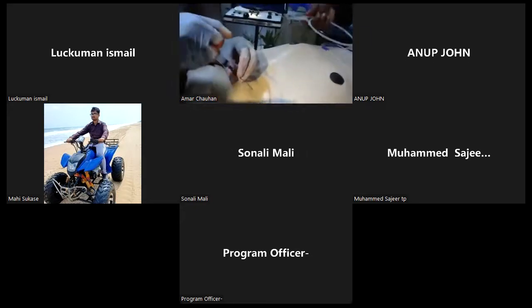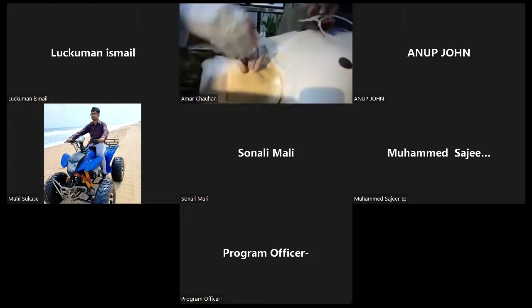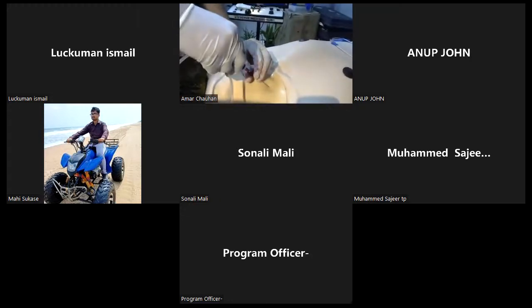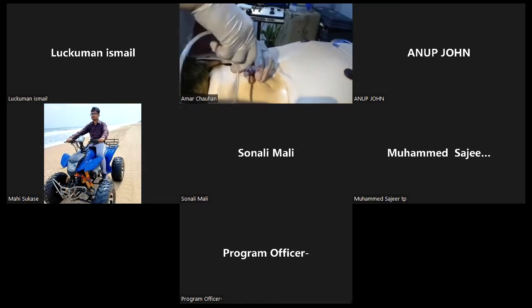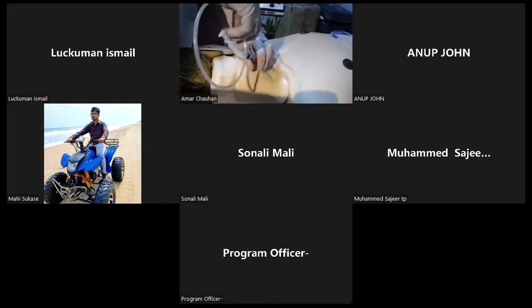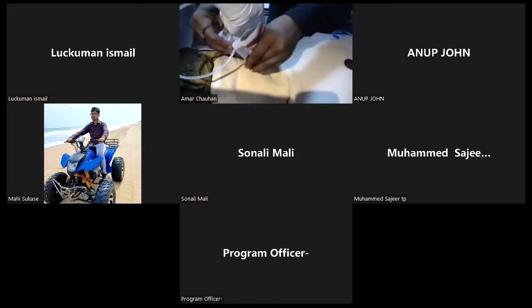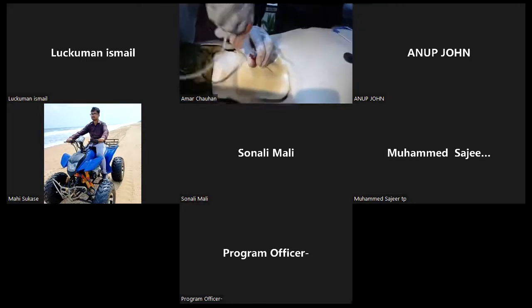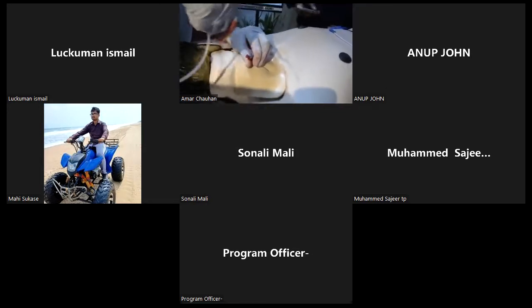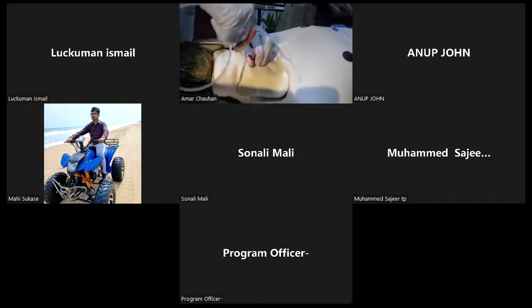This is a manikin, so I am just pushing back the blood. And for the other port, you can insert the guide wire. The guide wire should go free. I am pushing the guide wire. You have to go up to the second line, approximately 20 centimeters.